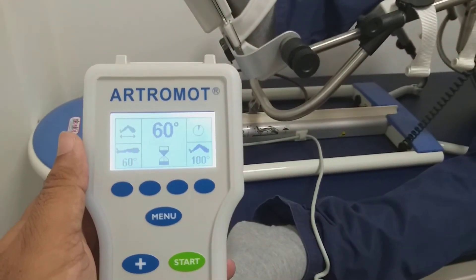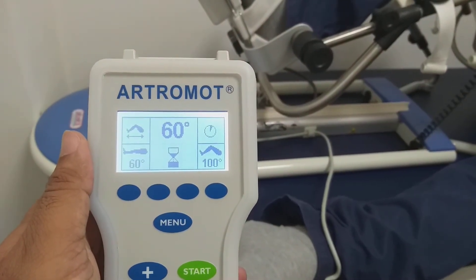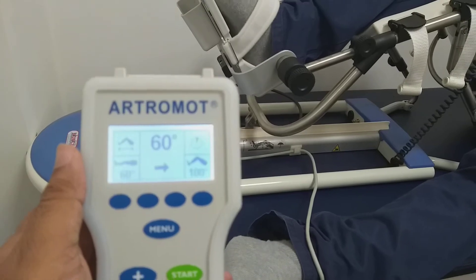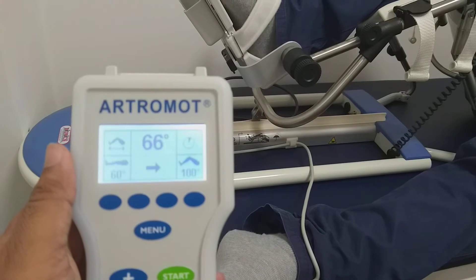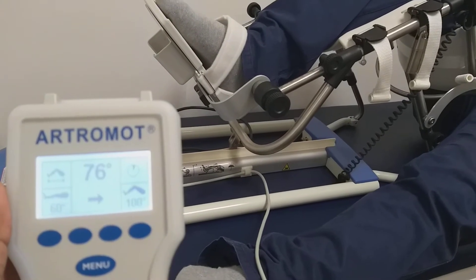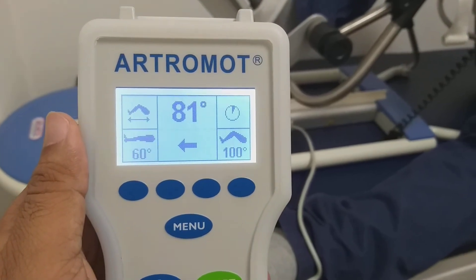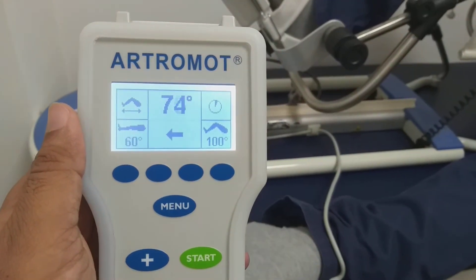Now again we can see — this is the extension pause. Once the extension pause is over, the flexion will start. Now flexion starts, and if the patient resists more than 5 kg, you can see there is resistance at 81 degrees, so after 81 degrees it goes into extension.